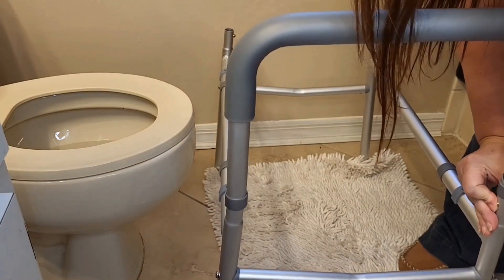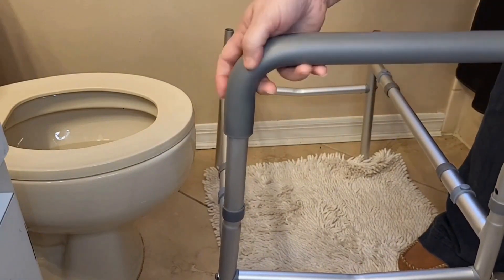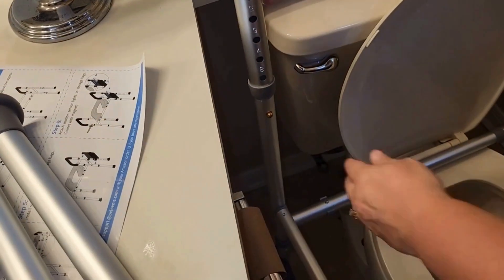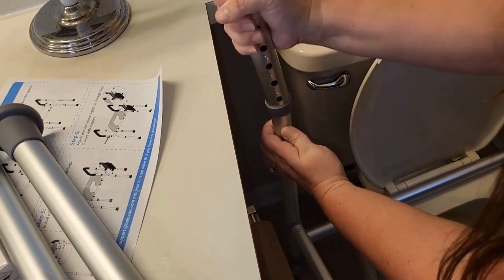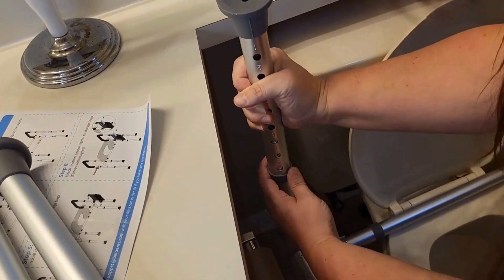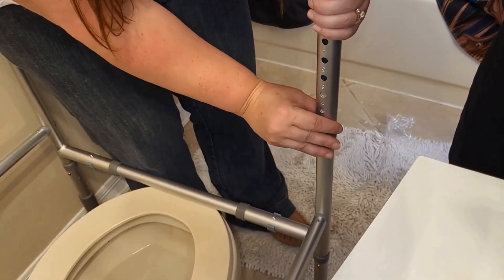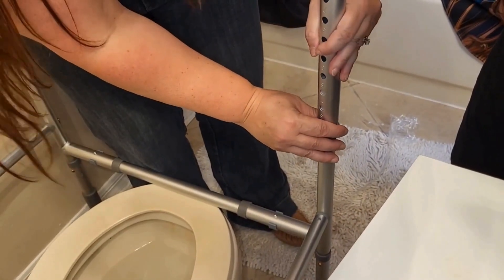I really like the non-slip handles — they offered very much comfort and support when getting up and down on the raised toilet seat. Now on the legs themselves, you can adjust the height from 19.5 inches to 23.5 inches, so it's easy to set it to your needs.